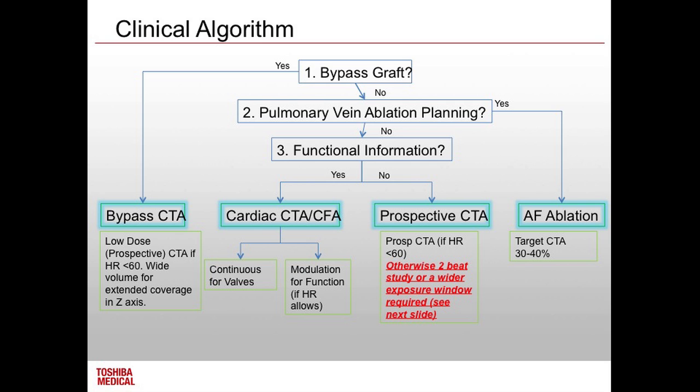So if someone comes in and you've beta blocked them, or you can't beta block them, asthmatics can't be beta blocked, for example. Because if they have an asthma attack, and I don't really understand it, but basically what the beta blocker does is stops that person's ability to get over it somehow. I'm not too sure, it takes a bit more research than I know, but if they've got asthma, you don't give it to them. So if their heart rate was high on your scanner, you've got a couple of options.